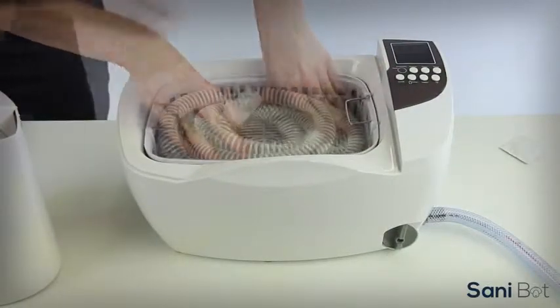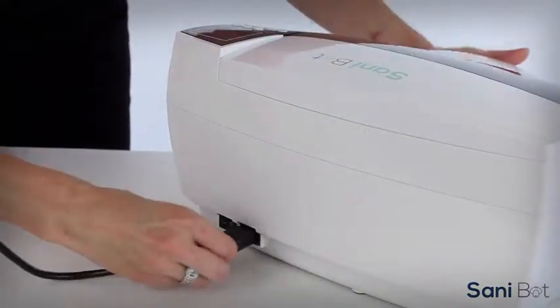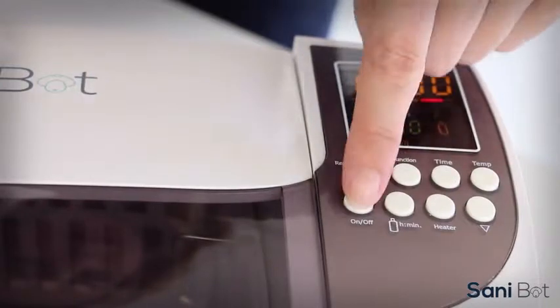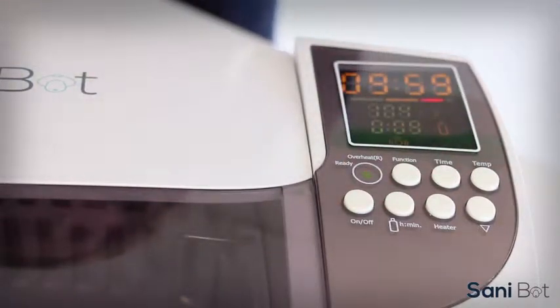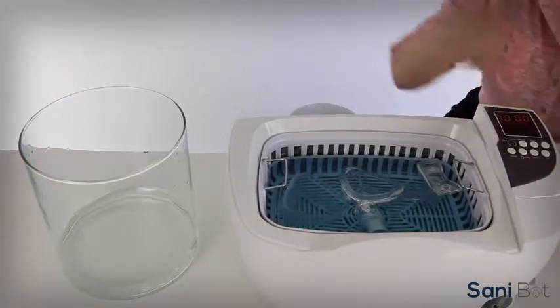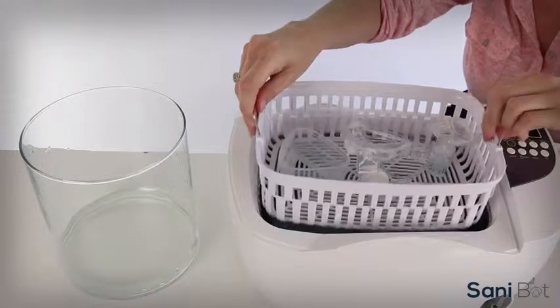Add a cleansing tablet to the water, connect the power cord and turn the switch on. Select the time you want to clean, turn the heater on to keep the water hot, and you're ready to go. When it's done, remove the lid and lift the basket out of the water using the handles. Careful, the water will be hot.